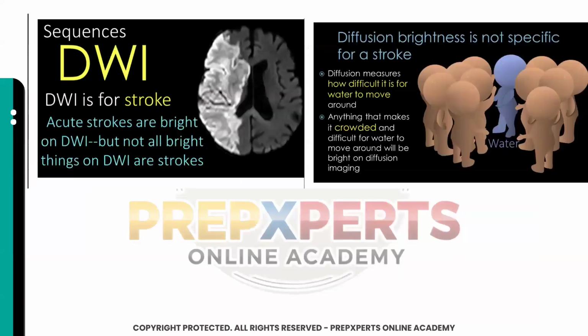Okay, next important friend of ours is DWI and ADC. In exam, there are going to be questions that are going to actually fry you on this concept. So keep your mind very sharp about DWI and ADC. What is that? DWI is basically diffusion weighted imaging. What is diffusion? Diffusion measures how difficult it is for water to move around.